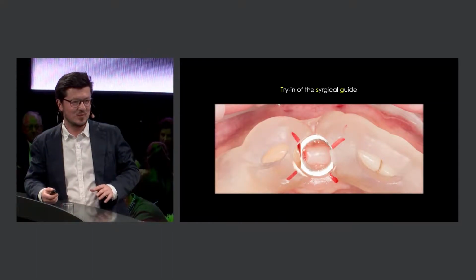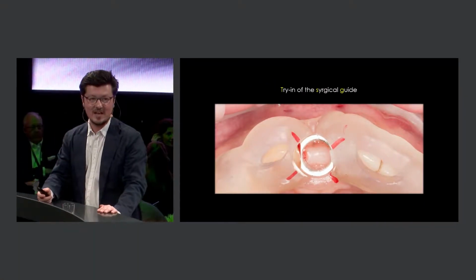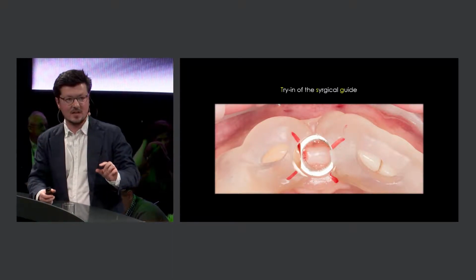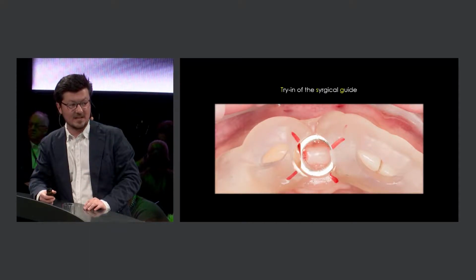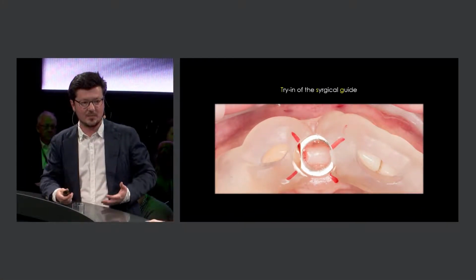We started with some debridement. You could see some plaque, so it's polishing, grinding, and we also used prep gel to get better soft tissue attachment at the end. Then we went for trying in the surgical guide. You can see that it has these inspection windows. We can check that it was sitting very precisely. This was very difficult in terms of planning because of the very narrow interproximal spaces, and it was crucial to place the sleeve, which has some horizontal parts, accordingly to the neighboring teeth. Otherwise, the fully guided protocol would not be possible.